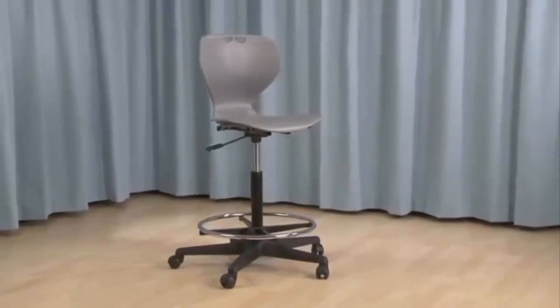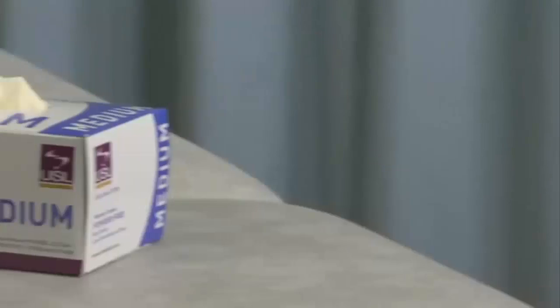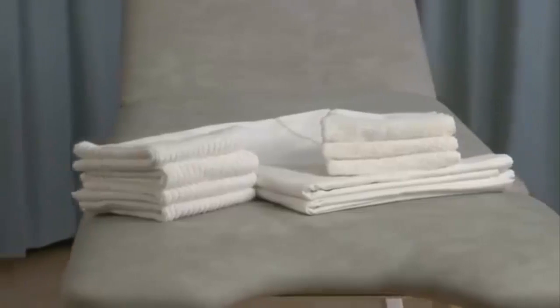An ergonomically adjustable chair. Acoustic and/or any water-based lubricant gel and gel warmers. Examination gloves. Bed linen and towels. And a sonographer's worksheet.